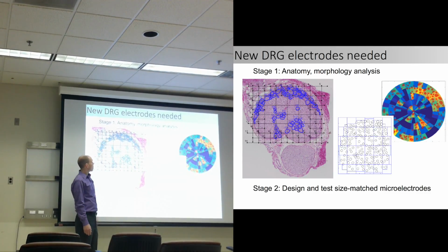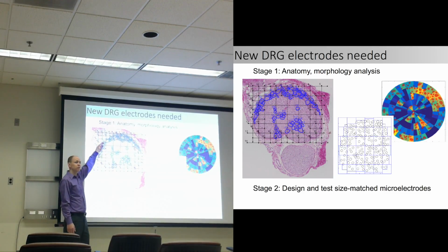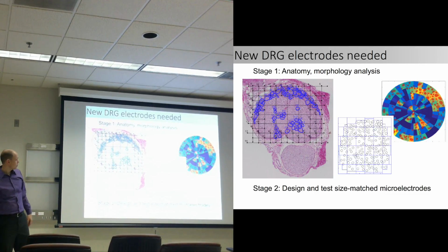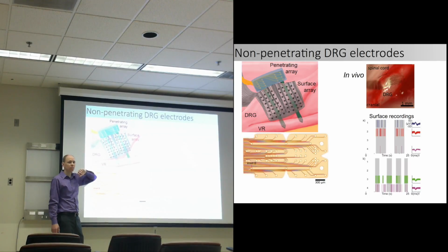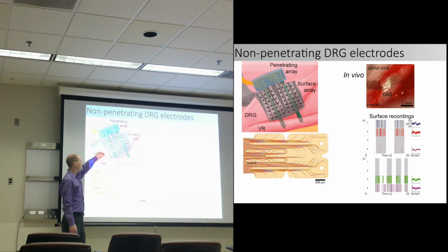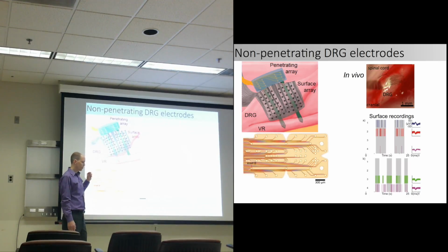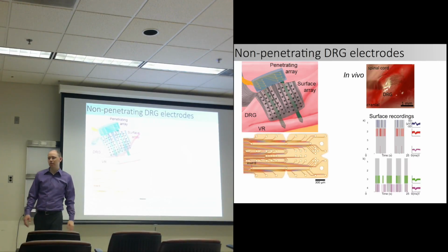So this is a very thin outer layer, just like in the peripheral nerves, and it's been hypothesized, and I showed you a little bit of a picture of it, that we can record from neurons with electrodes that are on the surface of the ganglion. So we're working with colleagues at the electrical engineering department here to come up with some surface electrodes to be able to record without penetrating into the spinal nerve. So this is a cartoon made recently in which both penetrating and surface components are used for trying to understand the physiology. But the surface electrode is really cool. We're using a very thin substrate, less than 4 microns, that can grip to the neural structures.